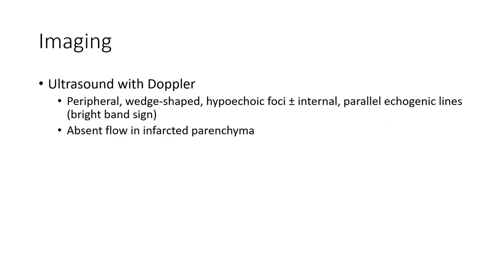On ultrasound with Doppler, there is a peripheral wedge-shaped hypoechoic area, plus or minus internal parallel echogenic lines. There is absent flow in the infarcted parenchyma on Doppler interrogation.